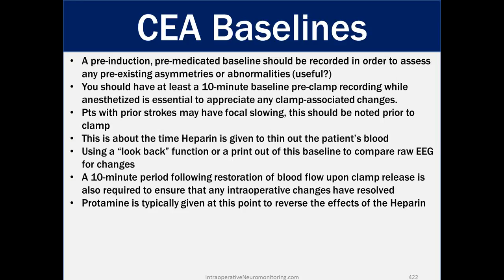You should have at least a 10-minute baseline pre-clamp recording while anesthetized, which is essential to appreciate any clamp-associated changes. So when you're setting your baselines, you want a good 10 minutes of unaffected anesthesia, no artifact, and your impedance is good. You have to really work to get something good up to that point. Your baselines don't start when surgery starts. Your baselines start 10 minutes before they clamp. Patients with prior strokes may have focal slowing. This should be noted prior to clamping.